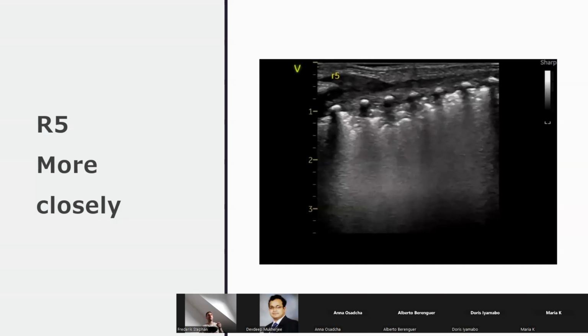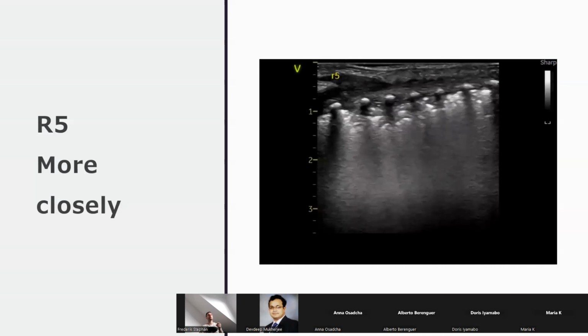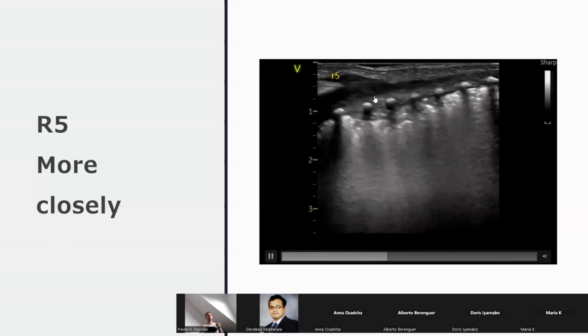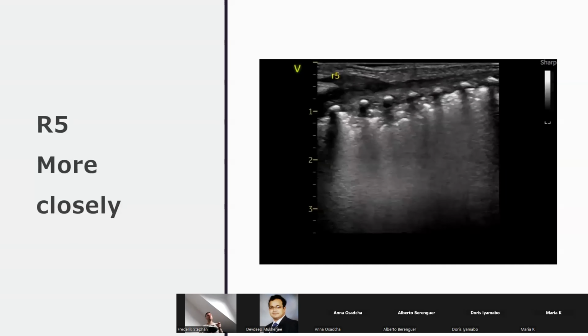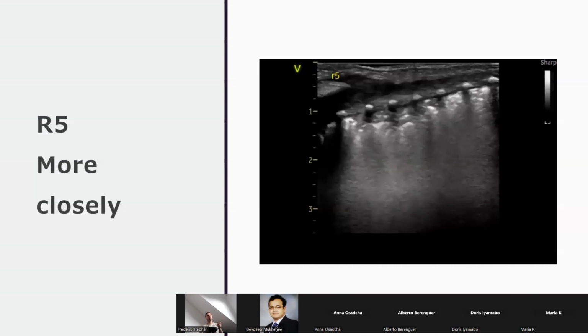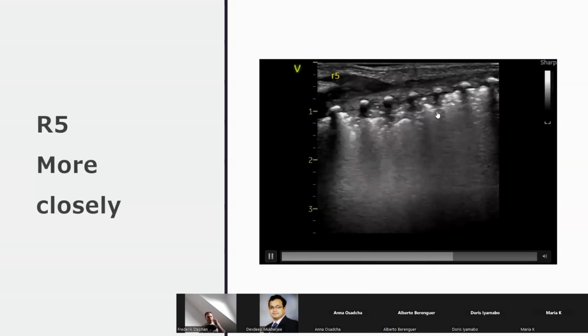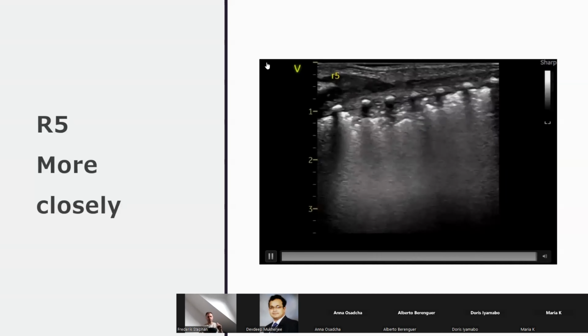Oh yeah, so we can see a lot more here. There's a lot of consolidations with atelectasis and, right, probably they're linear bronchograms anyway. Yep. I'd probably call them static looking at the picture I'm looking at. So you're right. So lots of static air bronchograms. You're starting to see a few linear ones just at the bottom.